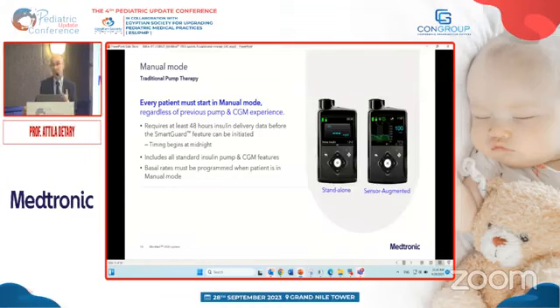However, at that time in my country, in the Czech Republic, they were developing insulin pumps. So the awareness of insulin pump therapy was rather high. However, I found from the doctor's perspective it was a rather difficult job to treat patients on the insulin pump, because the adjustment of the pump was not so easy. So that was the manual mode. However, by having the automation of the pump now, your job is much easier.